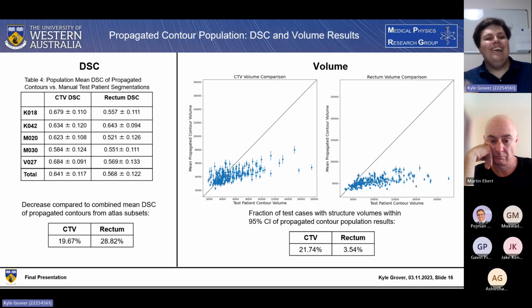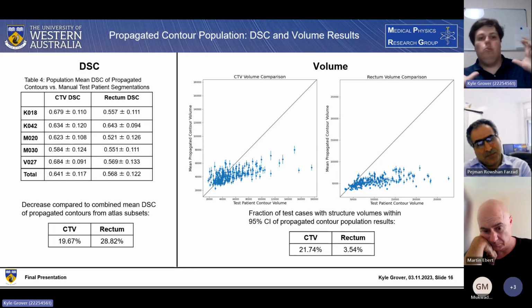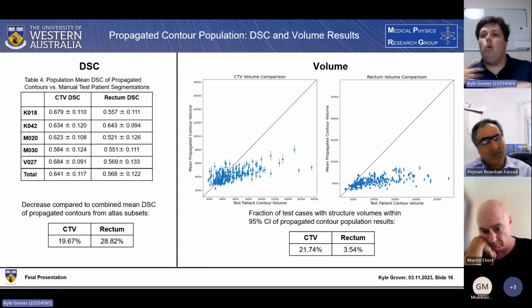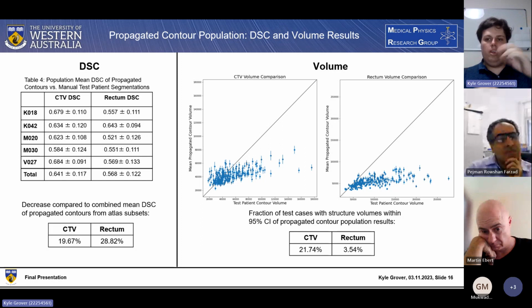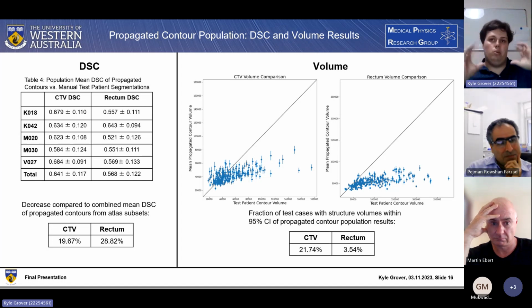But I imagine that with those we might actually get increased comparison, especially because Angel's original pipeline was designed to use as small an atlas set as possible to produce acceptable auto-contouring. So even though there was that very low region of agreement, it had good coverage, because it was specifically constructed so that those patients gave enough variability that the automatic segmentation provided good coverage of them.